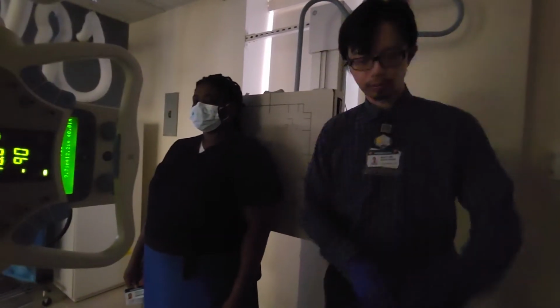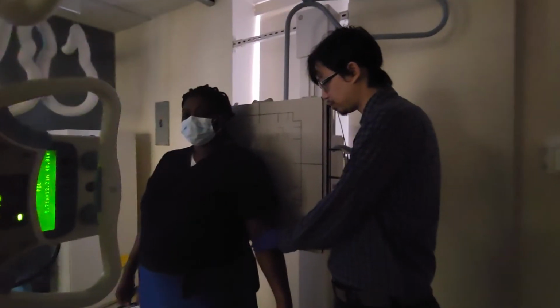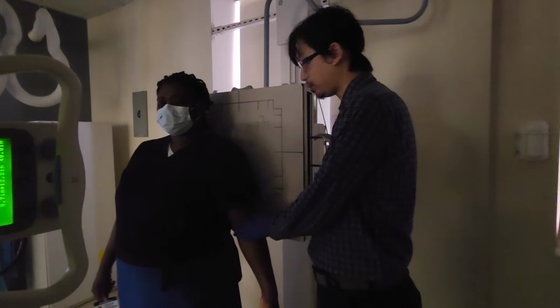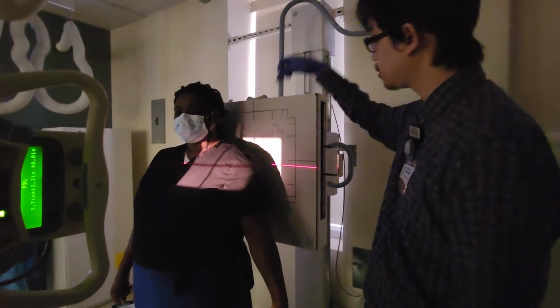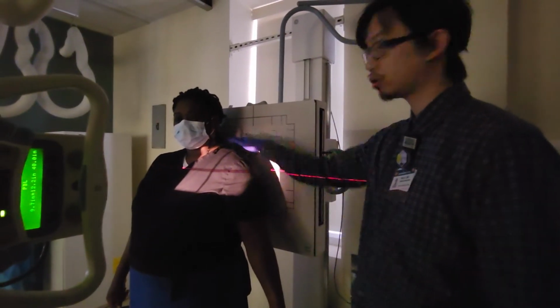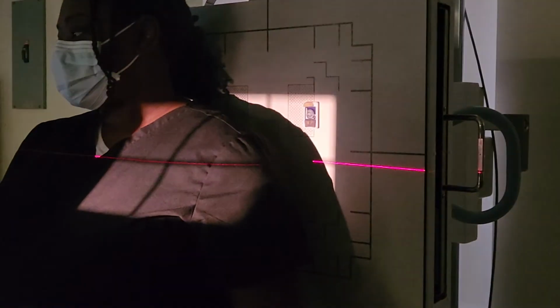So we're going to ask our patient to put the hand palm forward, facing our camera, our tube. And then we're going to come over here and check the epicondyles. And now we're going to adjust the elbow back and forth until those epicondyles are parallel to the IR. And this is our external rotation shoulder. Okay, from here, we make sure to mark. Okay, we collimate to the borders of our shoulder. In this case, we're already at the soft tissue border, so perfect. And we can ask our patient to hold their breath, X-ray, you can breathe.